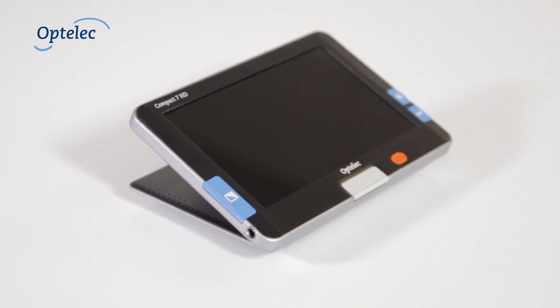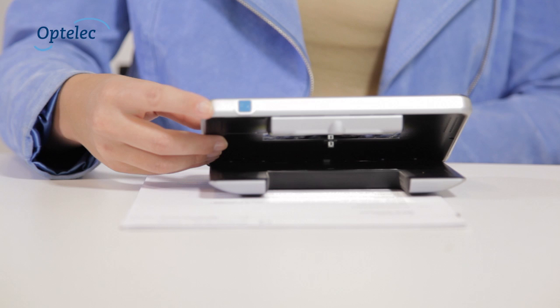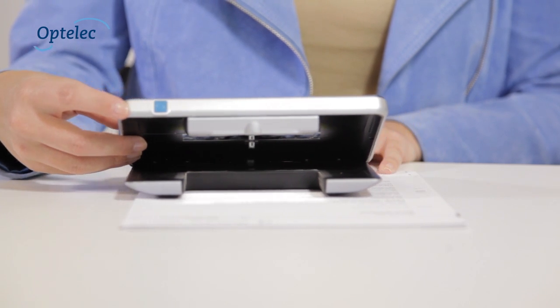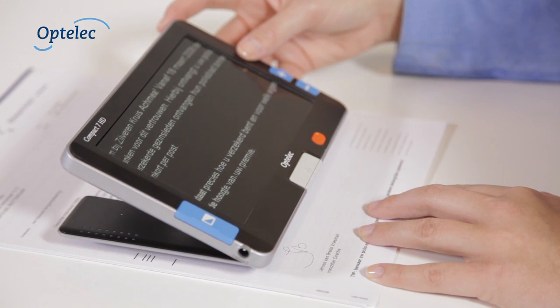Do you have trouble reading? The Optelit Compact 7 HD is the ideal solution if you're visually impaired, but you would like to read in a comfortable way. This video demonstrates how the Compact 7 HD can be used.